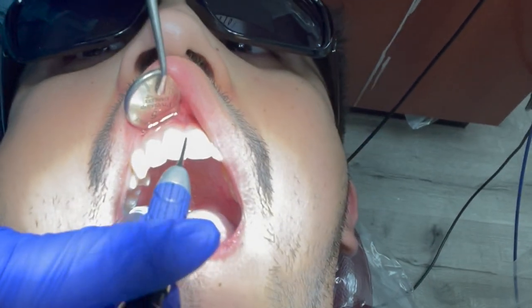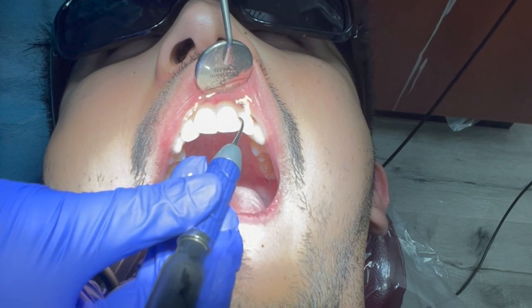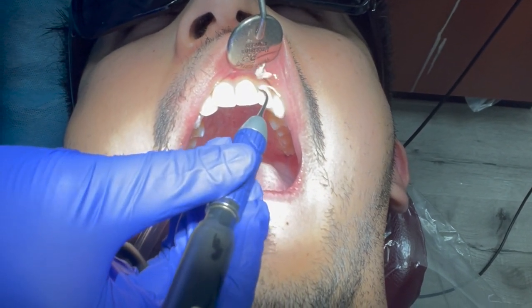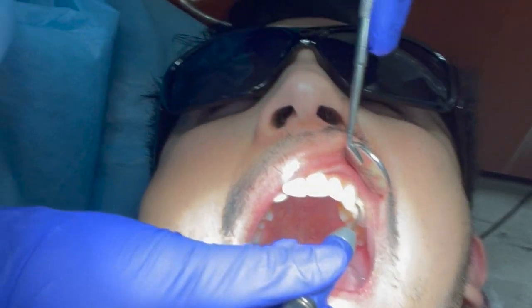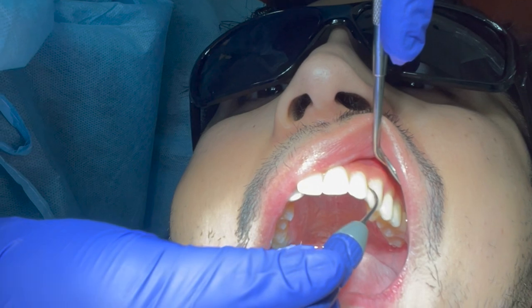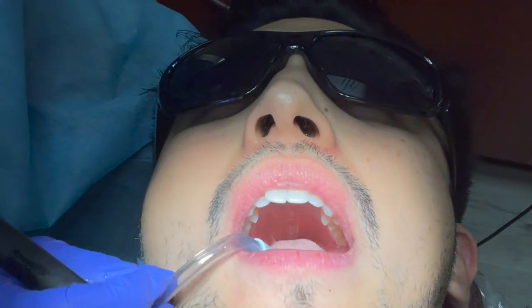That is what I have to listen to all day long when I'm using the cavitron to do the cleanings. The cavitron is also called an ultrasonic scaler, which uses high frequency vibrations, and the water just helps cool the tip down so the patient doesn't get burned. This is my favorite thing to use when I'm doing cleanings because it removes the plaque and tartar and it helps relieve my hands from hand scaling too much.